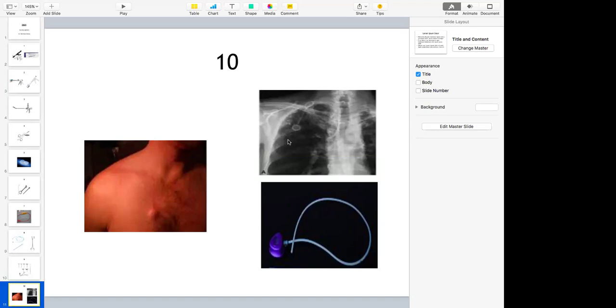Where do you put the chemoport chamber? Sorry, sir. I don't have idea that. In the infraclavicular area, just in the prepectoral plane, you do not keep it just subcutaneous because of fear of expulsion. So you make a deep pocket and put it there.